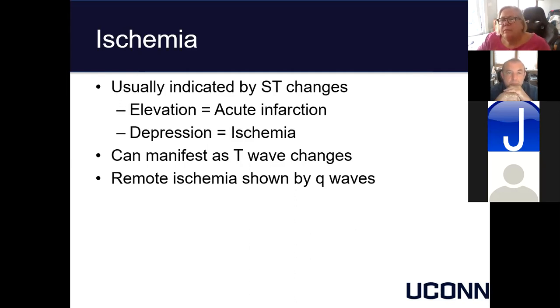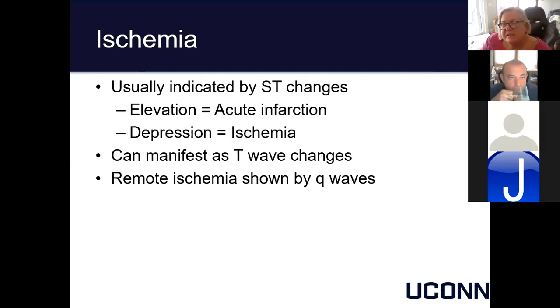Hey, Carol Ann, just a quick question. Yes. For a non-STEMI, you know what an ST elevation looks like, but what does a non-STEMI look like? A normal EKG. The guy's having a myocardial infarction and you can't see it on the EKG. That is true. Wow. So how do you measure that? Probably the BNP, I don't know. No. Troponins. Troponins and CPKs, CPK-MBs in particular. Okay. So you need to watch those labs. Okay, cool. Thank you. No problem.